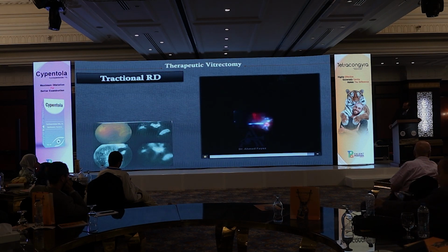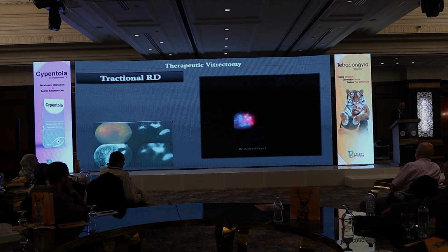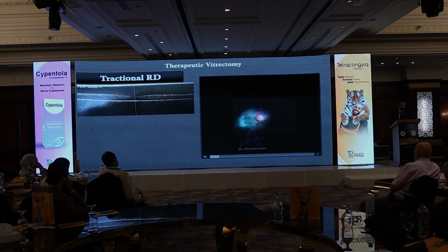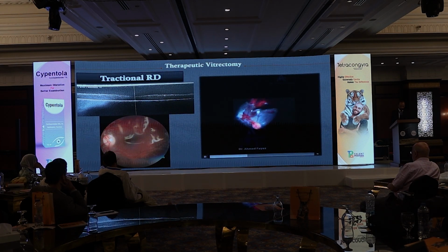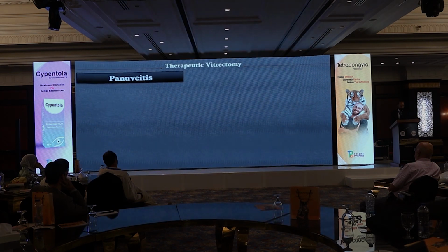After that we injected silicone in this patient, and as difficult as the operation went, the results were really good. This is the OCT after the operation, and this is the retina after the operation, which is really good. So you have to try the best with your patient to get the best results you can, and sometimes it will surprise you.